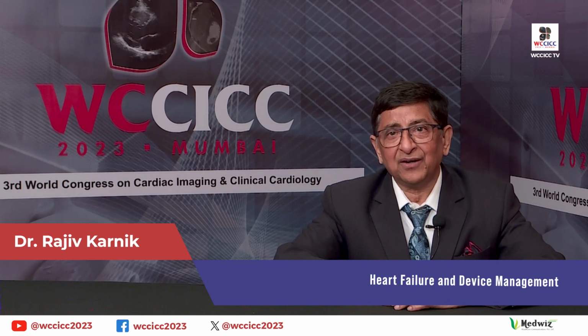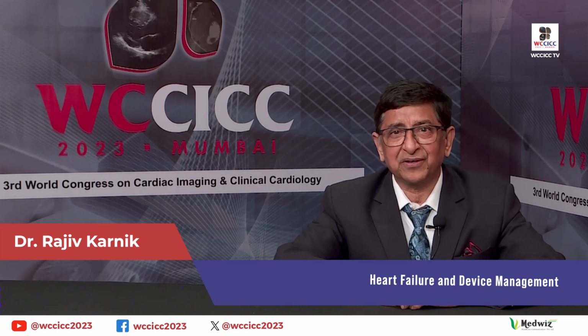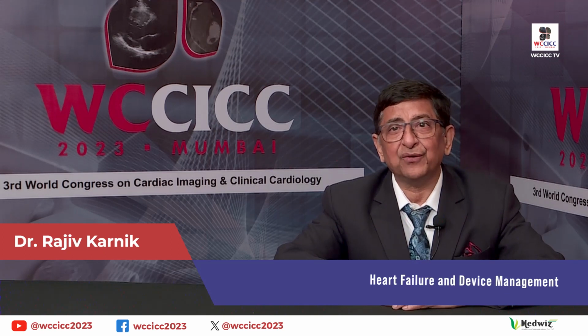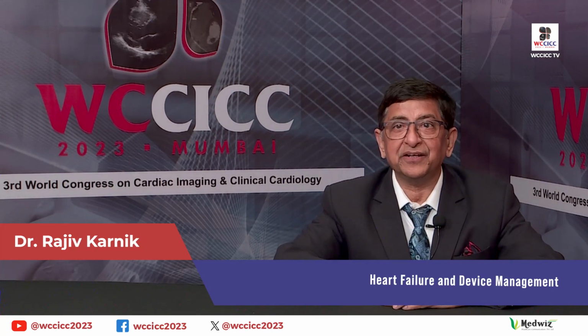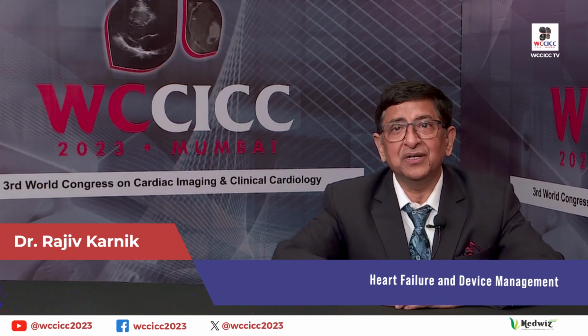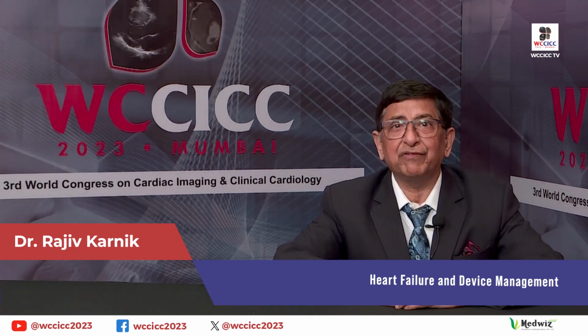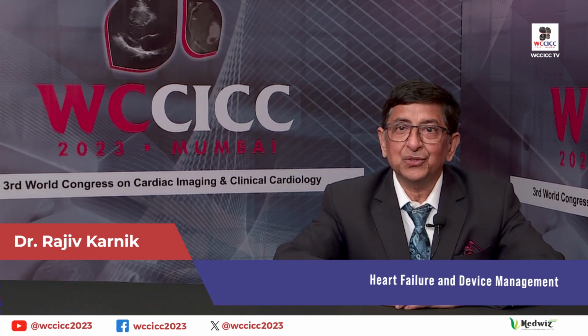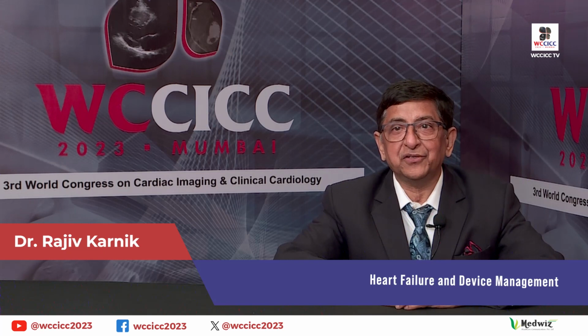The treatment for heart failure started way back in the 1950s, 60s, but then it was not really advancing till the turn of the millennium. Now we have a fantastic four medical pillars, or pharmaceutical armamentarium, but around the turn of the millennium, 2001, 2002, there were only two drugs which we were giving, which also did not have very good mortality reduction. So at that time, these devices came into the picture, and these devices were what is called ICD and CRT.